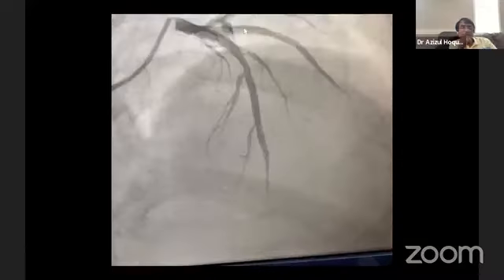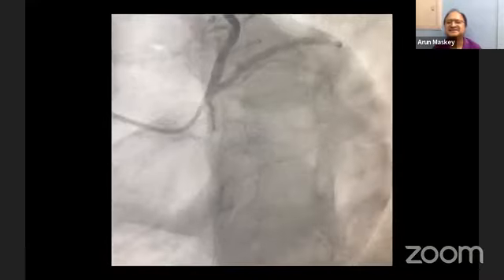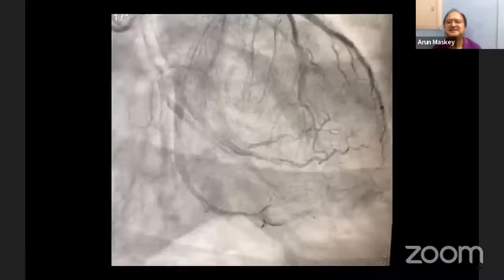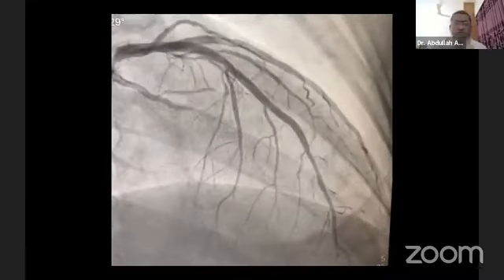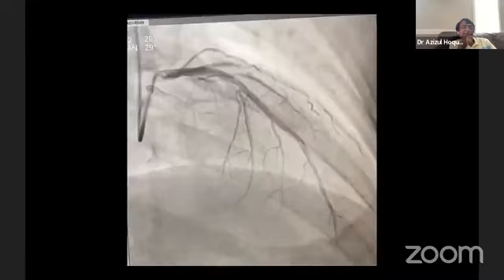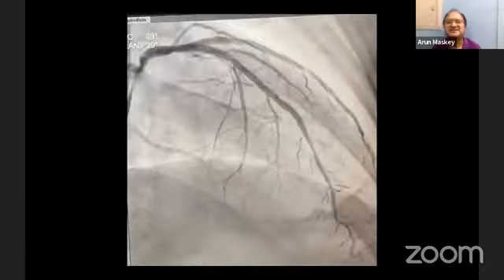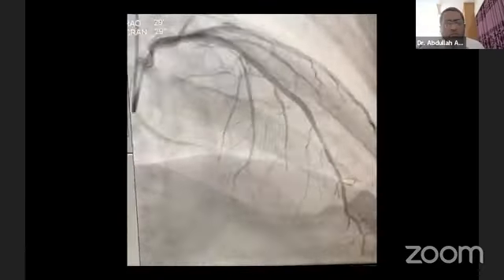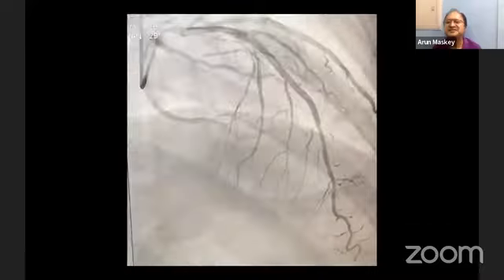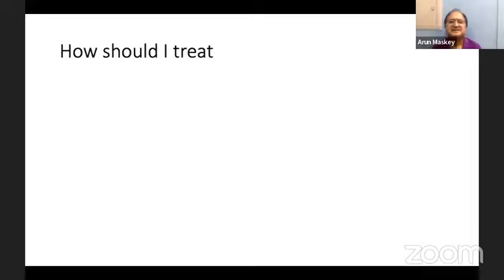So what do you think of the lesion in LAD? There's always the question of vulnerable plaques. The LAD lesion is not much significant, not critical. Did you have dissection there? I don't know, maybe later on. No. So is there anything you should do in this patient? No. We all are convinced this patient needs a cath, right? So we did nothing.